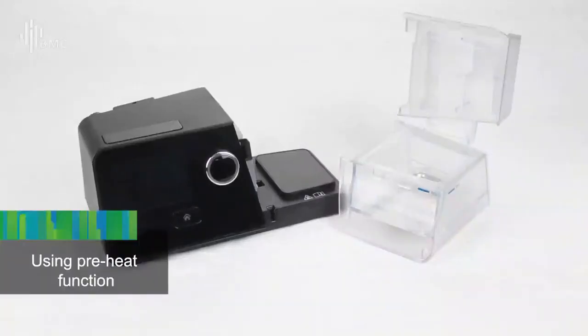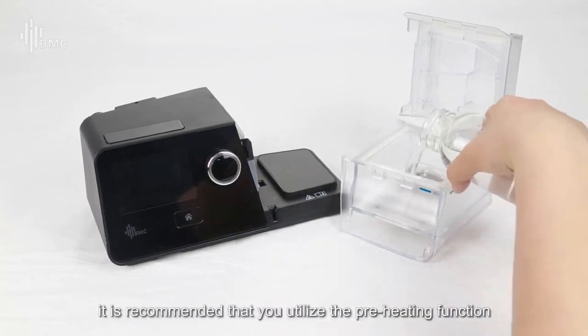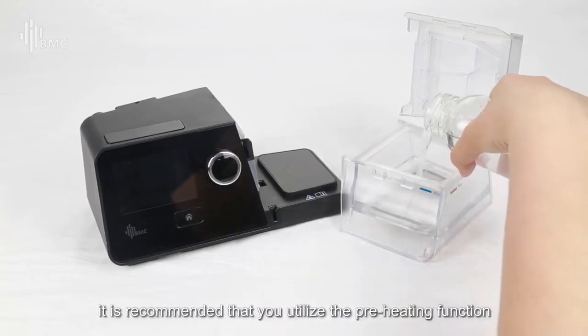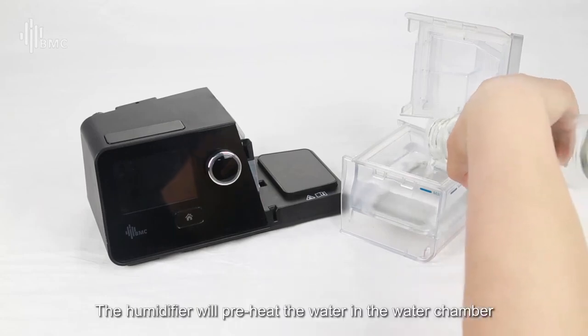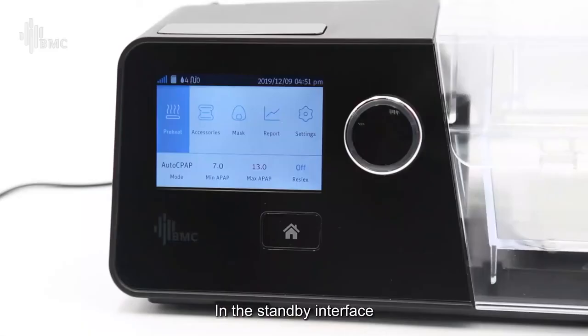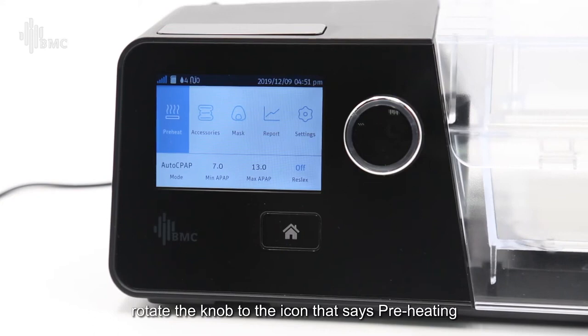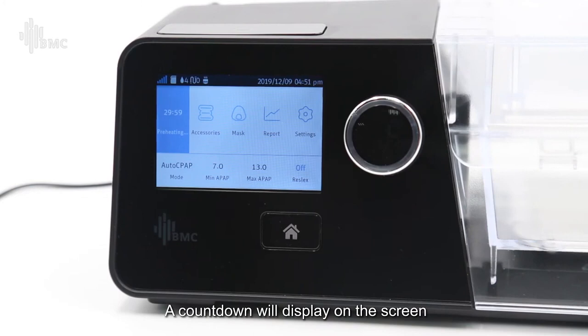Using preheat function. In the cold and dry weather, to increase your comfort, it is recommended that you utilize the preheating function. The humidifier will preheat the water in the water chamber so that you can enjoy warm airflow from the start of your nightly therapy. In the standby interface, rotate the knob to the icon that says Preheating. Click the knob to enable the preheating function. A countdown will display on the screen.